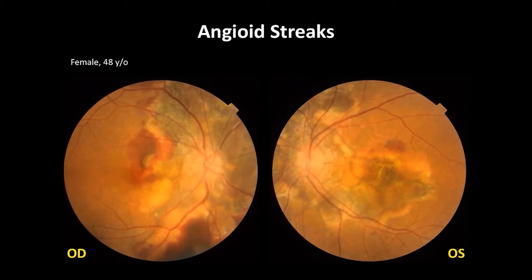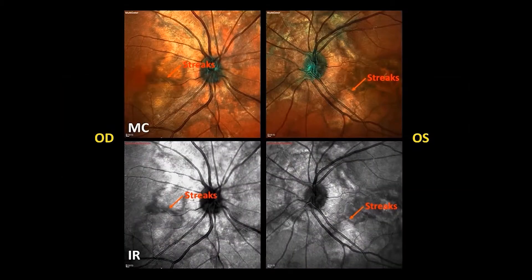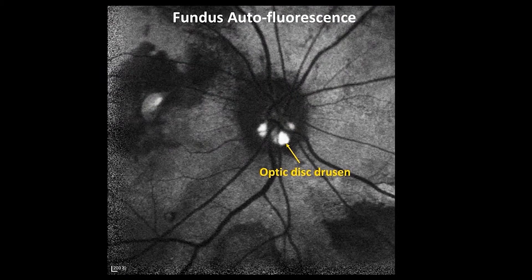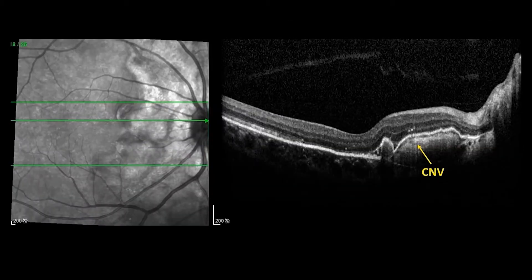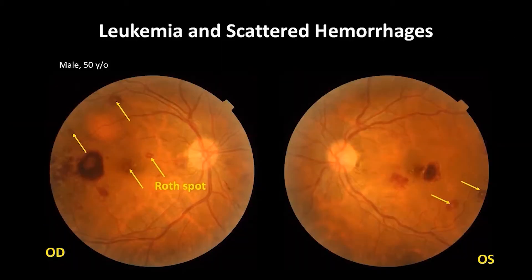In angioid streaks, multicolor imaging is able to demonstrate the streaks better than color fundus photo. Fundus autofluorescence and OCT showed the optic disc drusen. OCT found CNV as well.